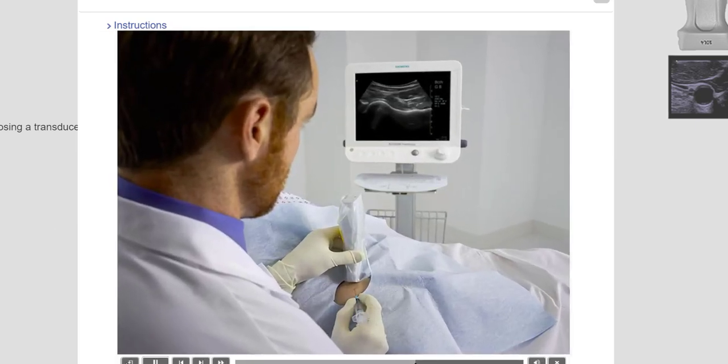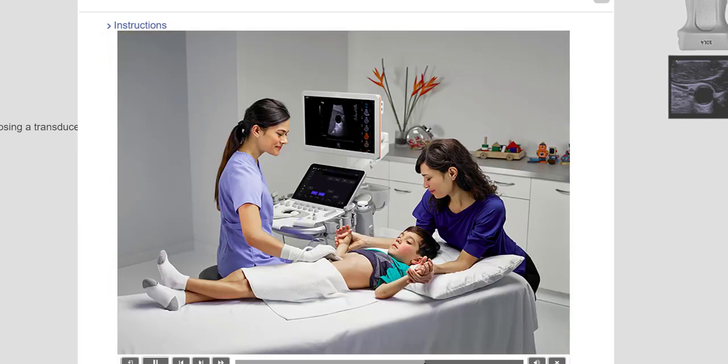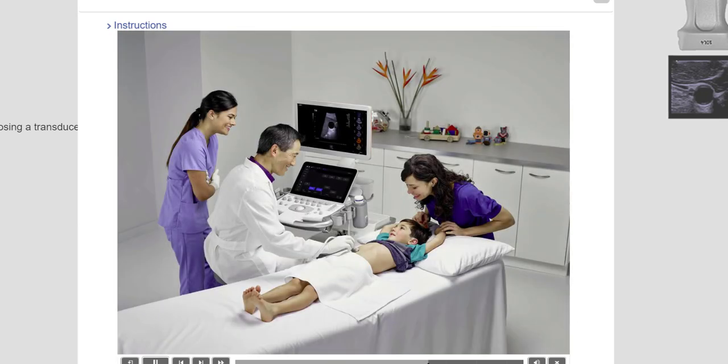This clinician is using a wireless curved transducer during an ultrasound-guided musculoskeletal hip injection. The FOV of the curved transducer is also suitable for pediatric abdomen examination. The transducer that is appropriate for an abdominal ultrasound on an adult may be too large on the child's abdomen, and the frequency range too low for examinations on children.